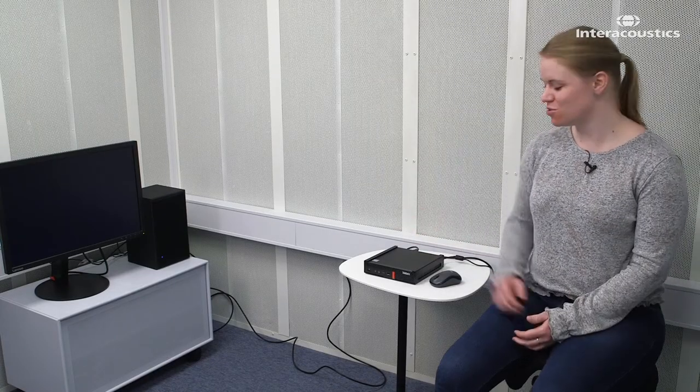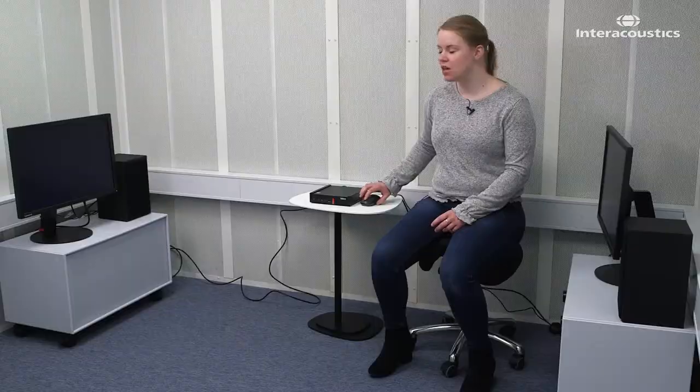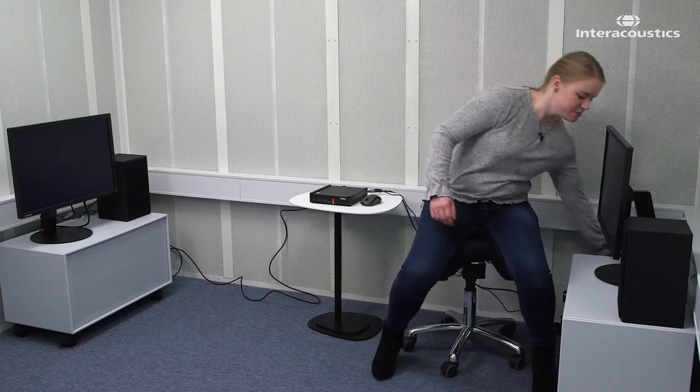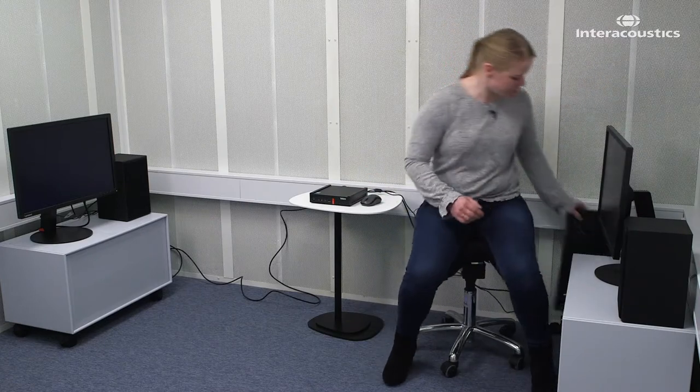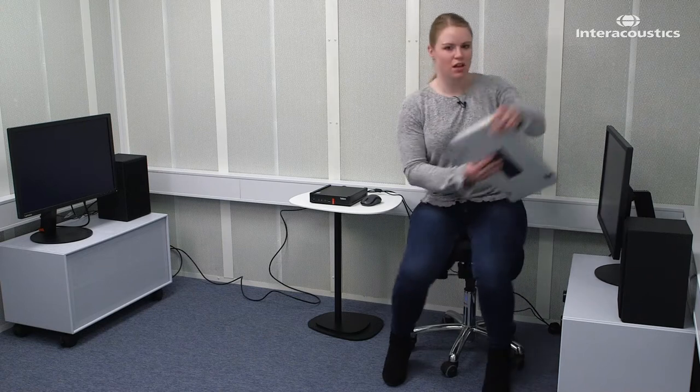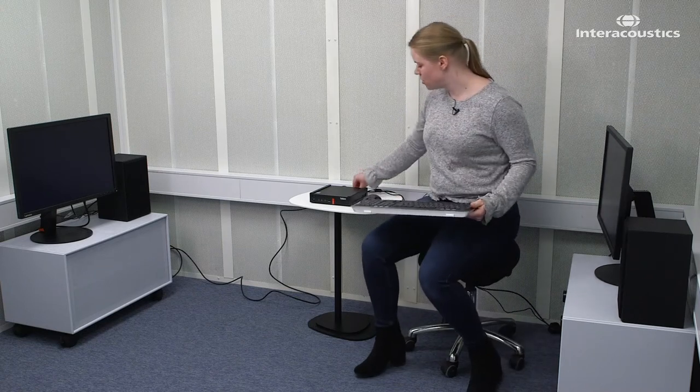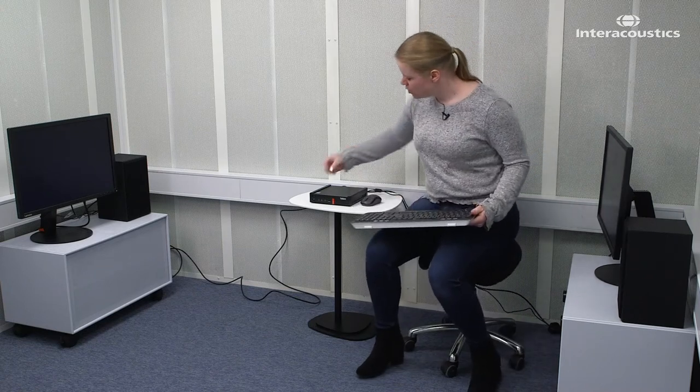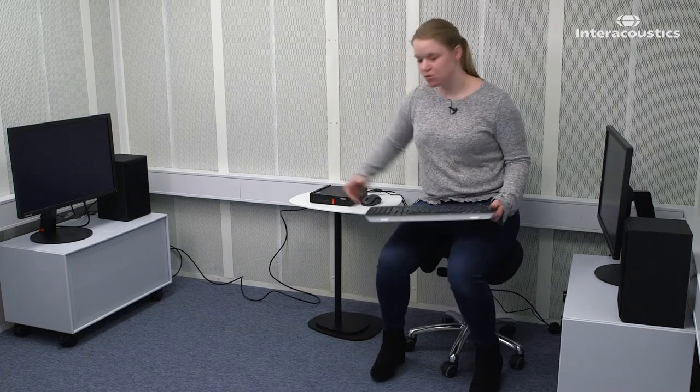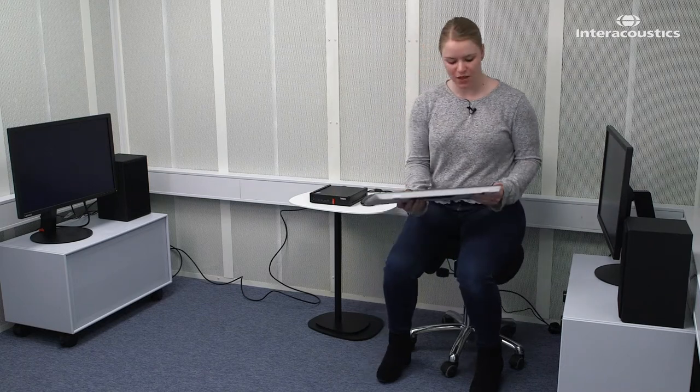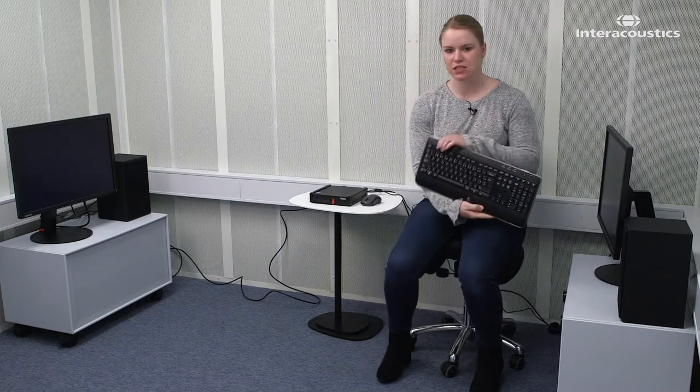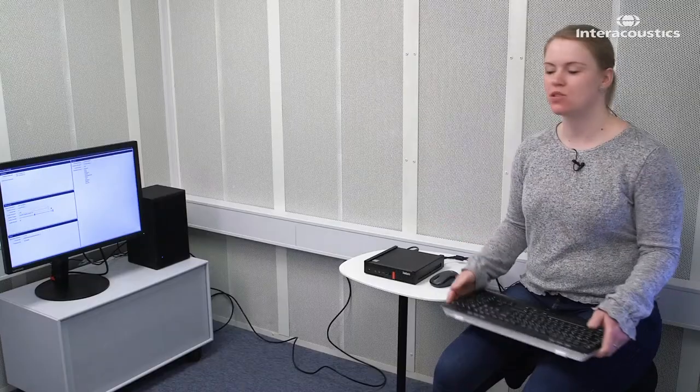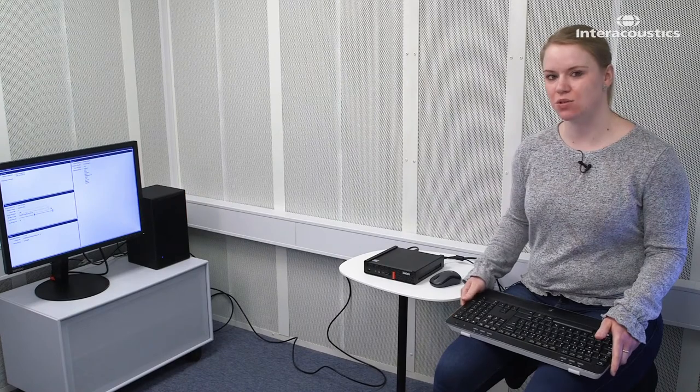If you want to change which screen directs to which mouse click, then you enter the setup menu, and I will just demonstrate that. You need to have a keyboard where you just connect it through the USB. Then you press the F1 key to enter the setup screen.